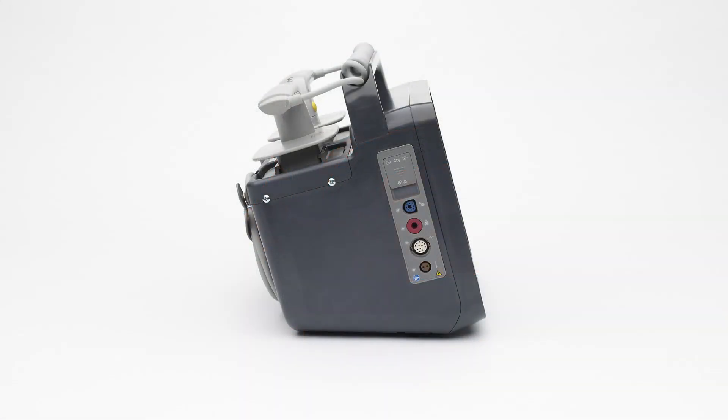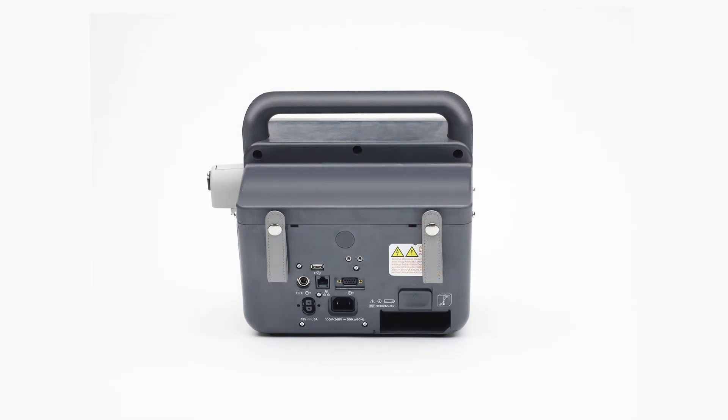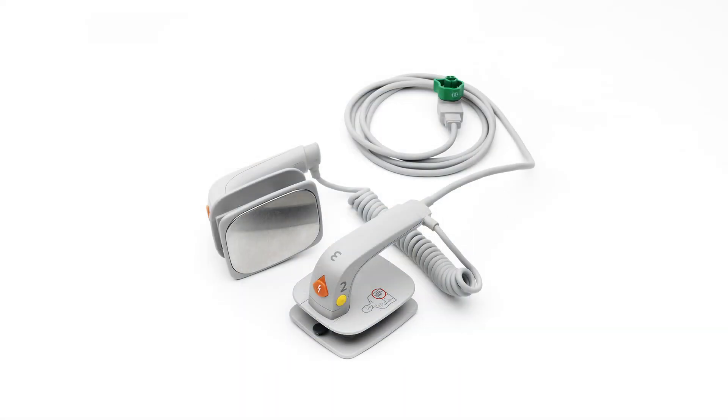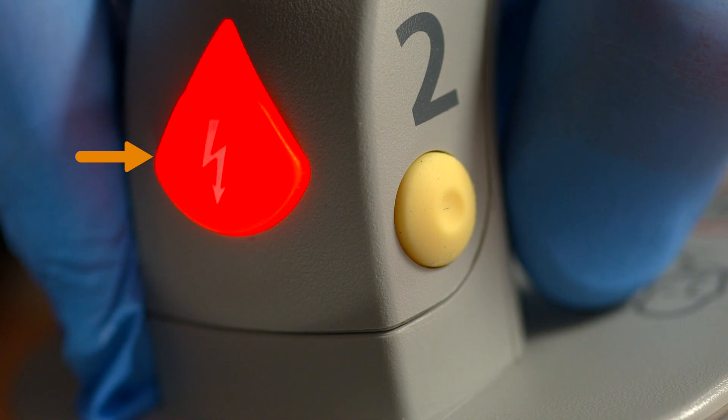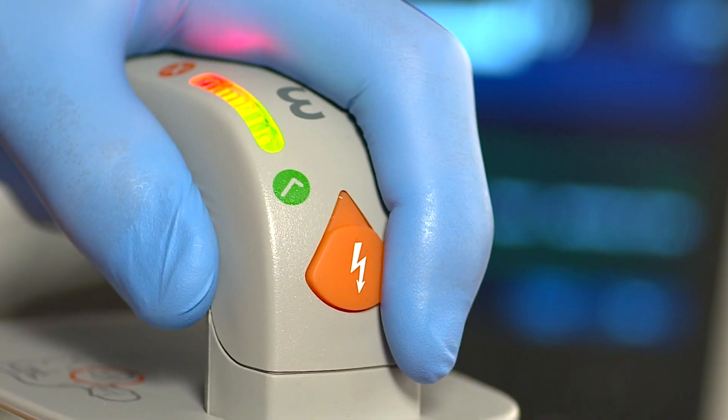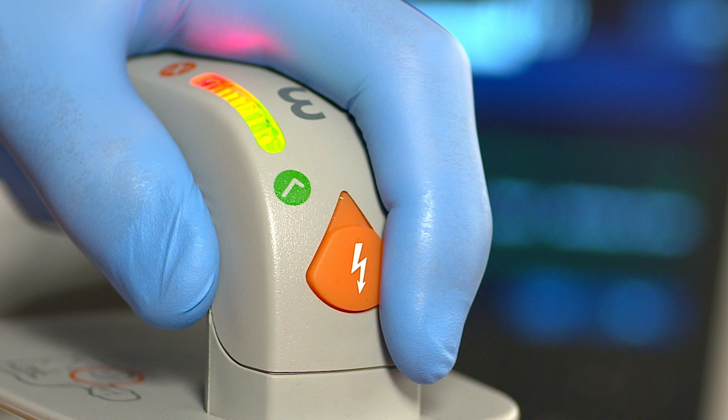Depending on your configuration, the top of the HeartStart Intrepid may consist of a handle and optional external paddles, or for non-external paddle users, a paddle plate and solid handle. The HeartStart Intrepid paddle set can be used on adult, child, and infant patients. Both paddles have orange shock buttons that flash when the defibrillator is charged, and the sternum paddle has a patient contact indicator — orange or red lights indicate poor patient contact, while green indicates good contact.